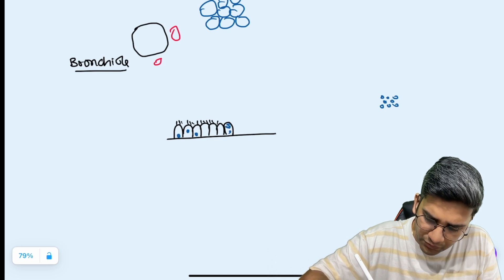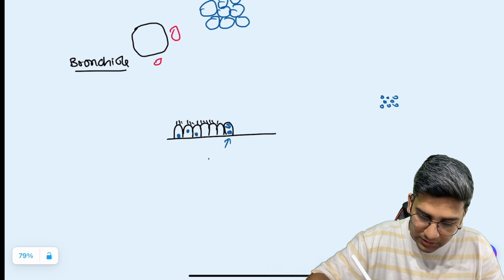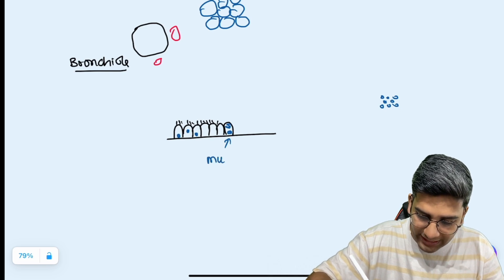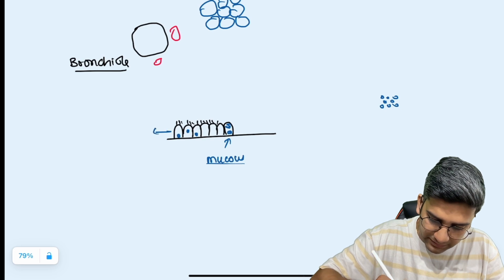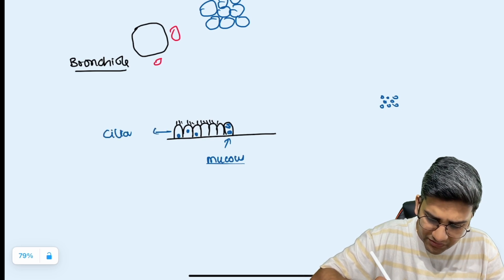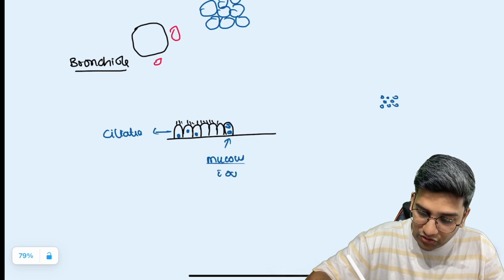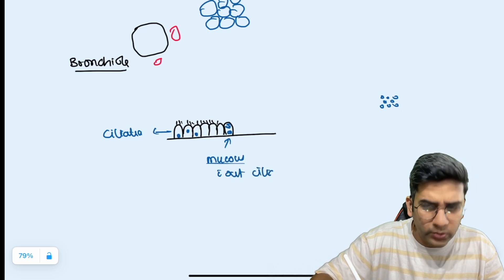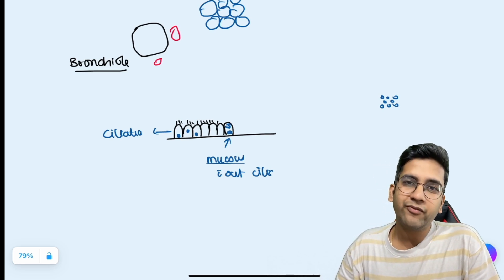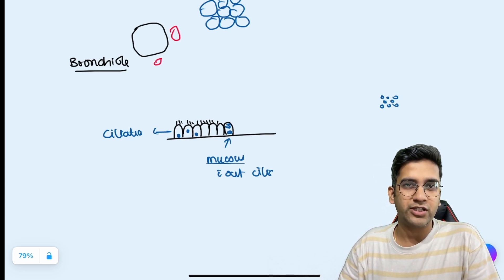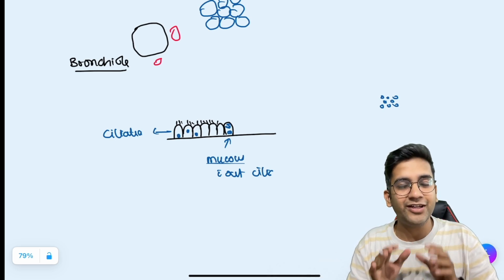In between the ciliated columnar cells, you will have mucin-secreting cells. You can identify them by the good amount of mucin at the top and the nucleus at the bottom. Mucin-secreting cells do not have cilia. So you have ciliated epithelium, and in between them mucin-secreting cells without cilia — that's a very classical finding seen in every bronchiole lining.